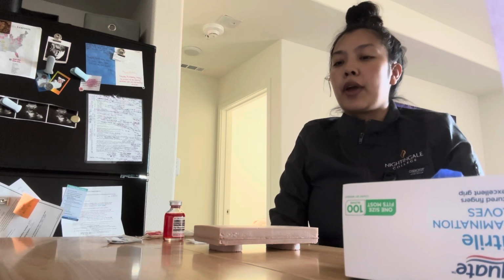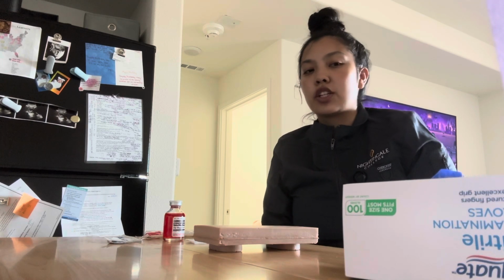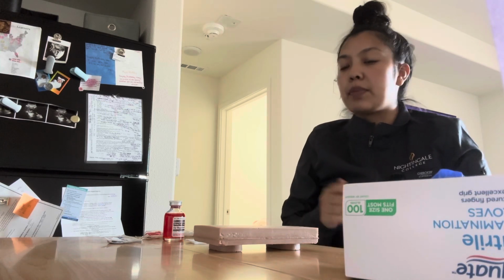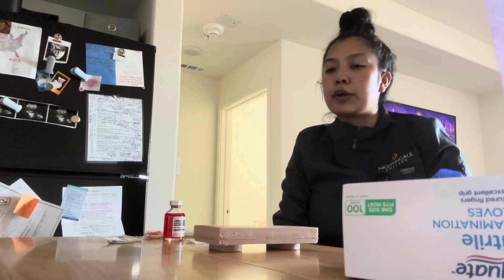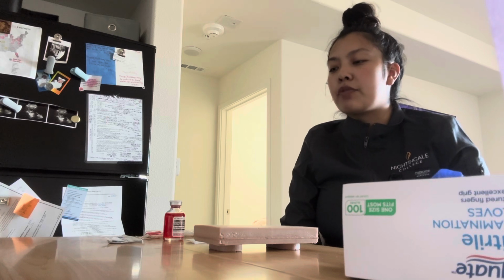Tupo. Okay, so I'm gonna go ahead and check the patient's wristband, see if I have the correct patient, and see if they have an allergy wristband. Patient does not have an allergy wristband, but I'm also gonna ask the patient, do you have any allergies that I need to know of, Ms. Tupo? No? Okay, perfect. Have you ever had a TB test done before?